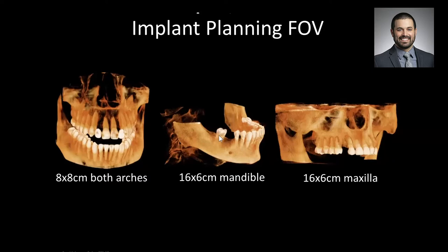We commonly will scan based on the planned implant site, the mandibular arch or the maxillary arch only. And the reason for that, as I stated earlier, is once we cut that other arch out of the scan field of view, some artifact and noise drops out, and we get a little clearer image. We also maintain those occlusal contours.